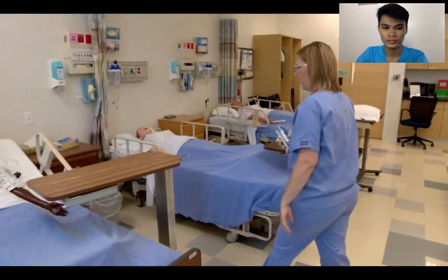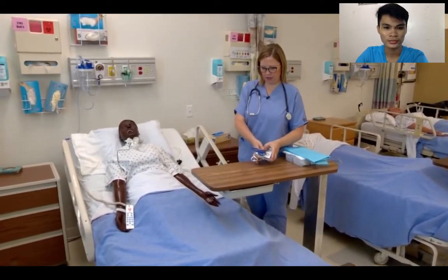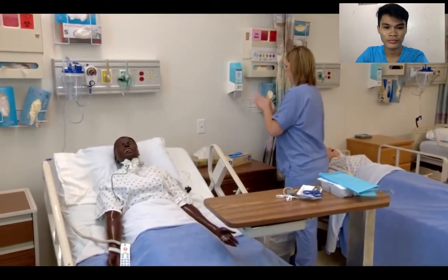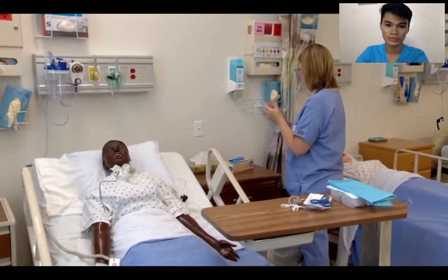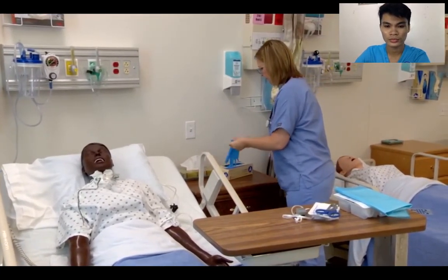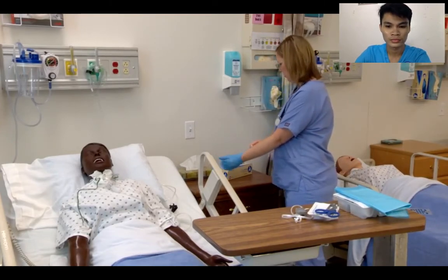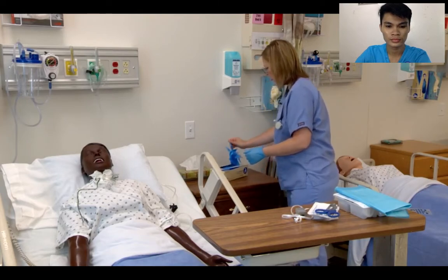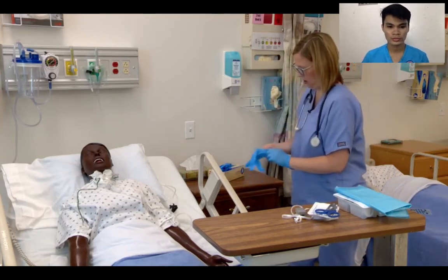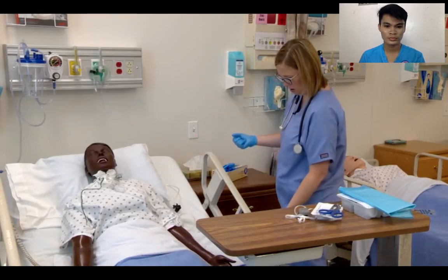Knock, knock, knock. Hi, Mr. Jones. It's Sarah, your nurse. I'm here to perform trach care and suctioning. How are you today? Let's get some gloves on here. I hear some rattling in your chest there. I think it's important that we get that gunk out of you. Just going to bring that up here.